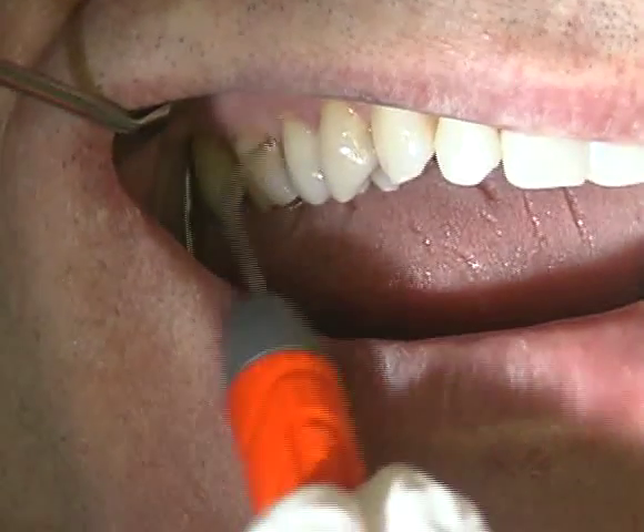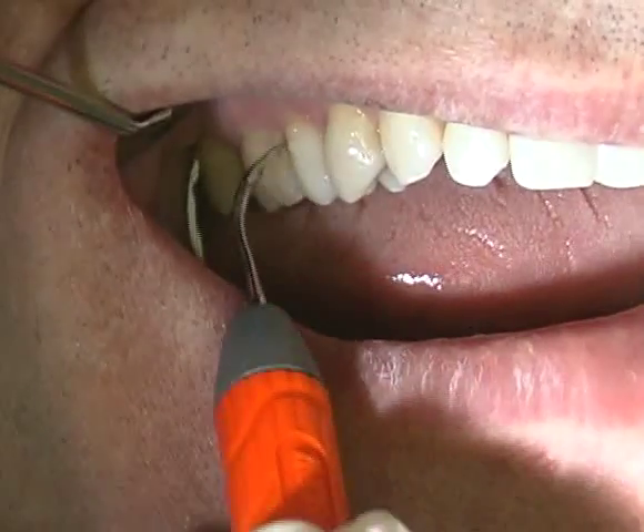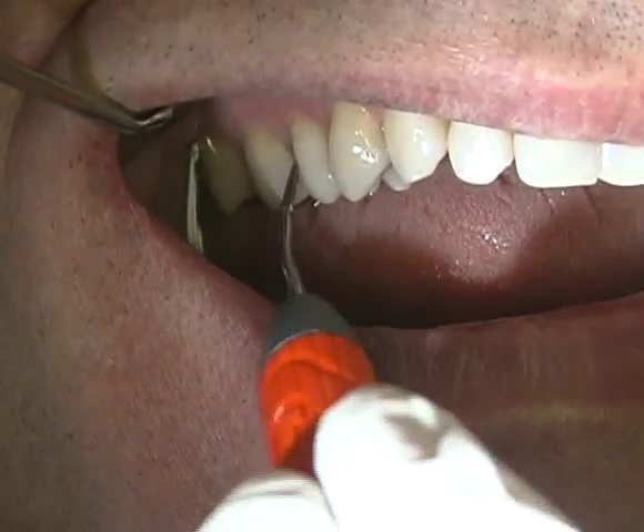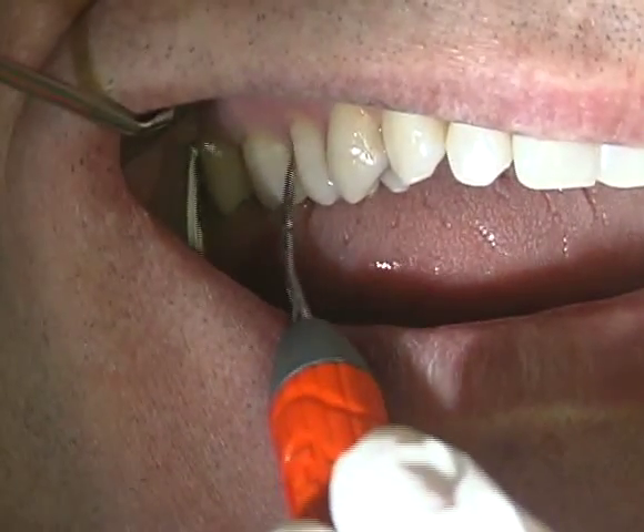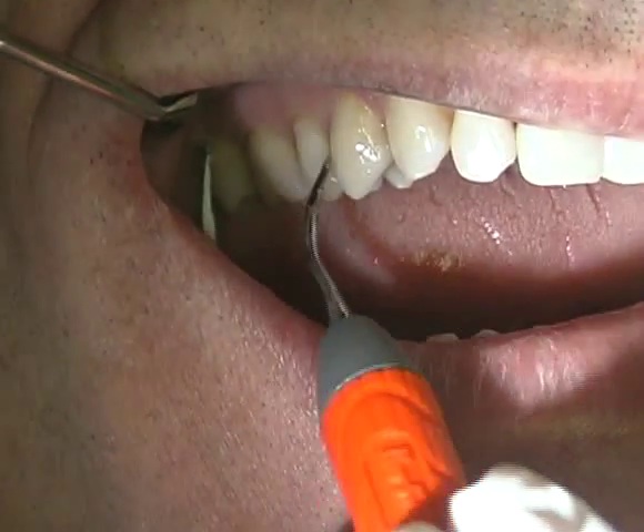The number 1000 triple bend, shown here adapting to the mesial and distal surfaces of the upper right quadrant, is an ideal instrument choice for heavy deposit removal in hard-to-reach areas.